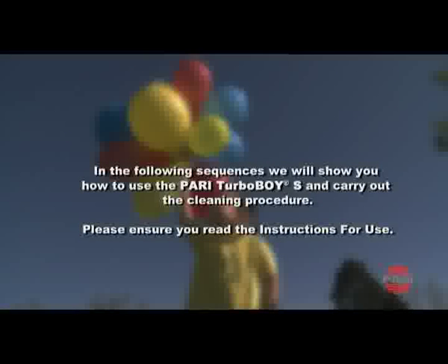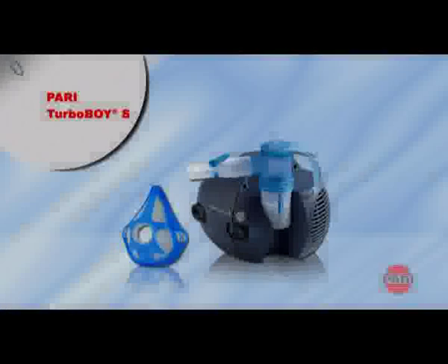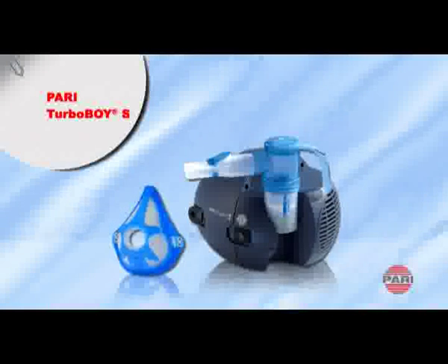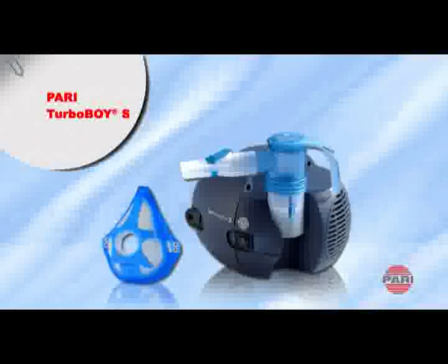In the following sequences, we will show you how to use the Parry Turbo Boy S and to carry out the cleaning procedure. Please ensure you read the instructions for use. Your doctor has instructed you to use the Parry Turbo Boy S. In this video, we would like to show you how to use the Parry Turbo Boy S correctly and provide you with valuable tips on handling and cleaning your inhalation device.